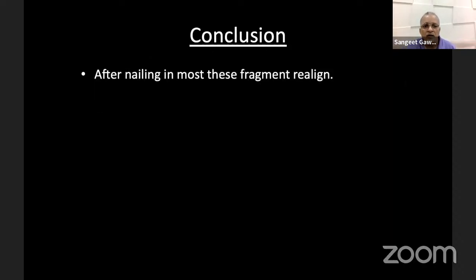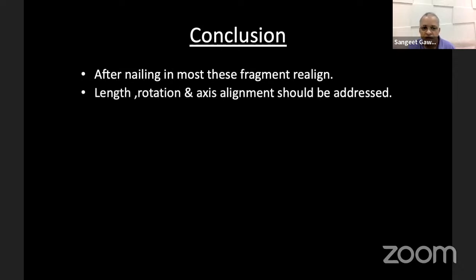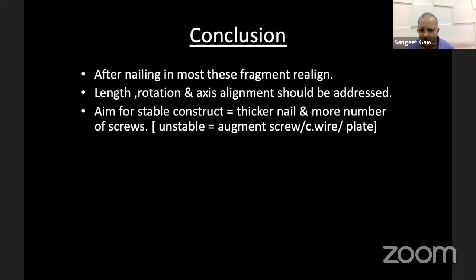To conclude, after nailing, most of these fragments will realign and they do not need any separate fixation. Provided the length, rotation, and axial alignment are addressed, these fragments should be left alone. The aim of a stable construct should be a thicker nail and more screws in the proximal and distal fragments.